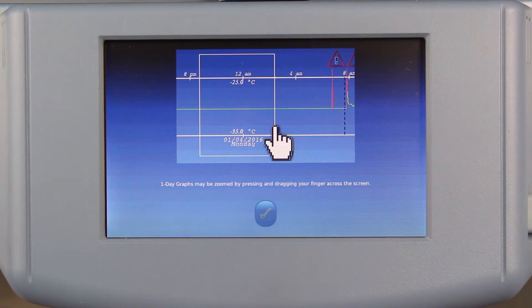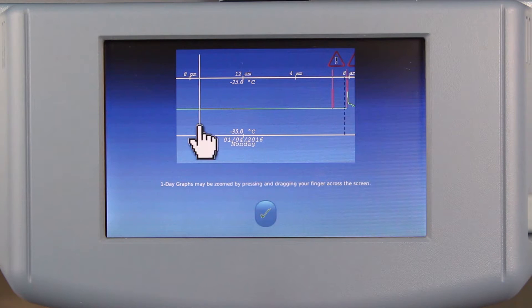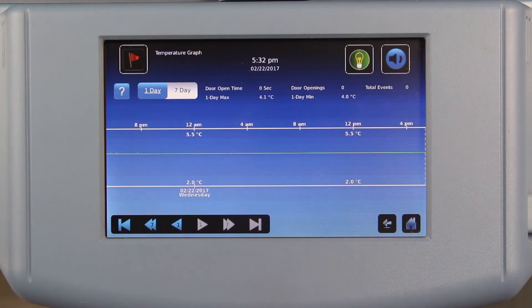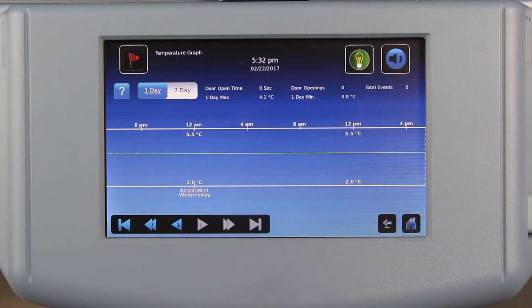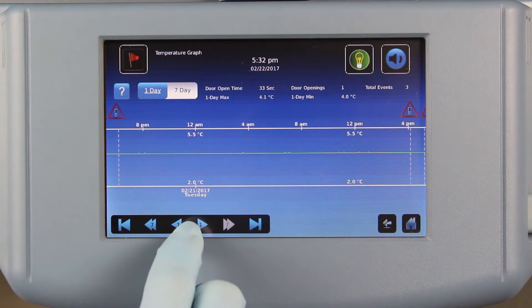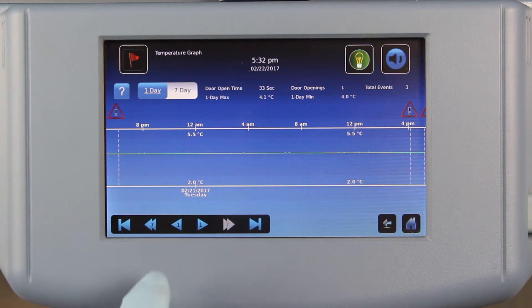To demonstrate this feature to users right on the display, a Help button has been added, which brings up an animation. The interactive graph enables users to view up to 62 days of temperature data. To make this easier, we have changed the interface to use jump-forward and jump-back buttons instead of scrolling. You can now view previous days or weeks of data more quickly.